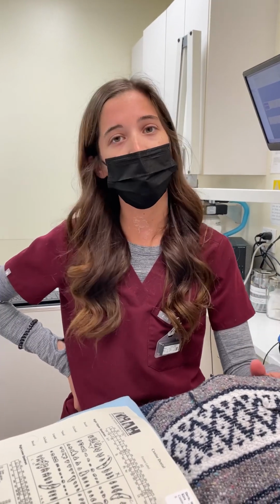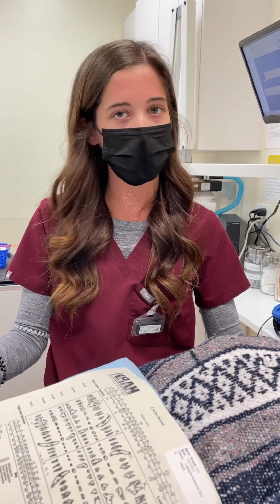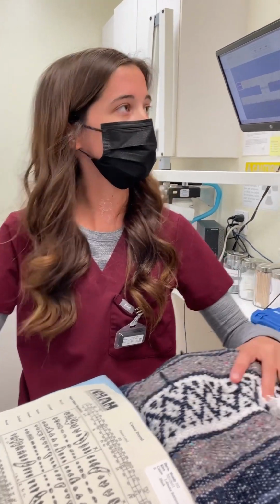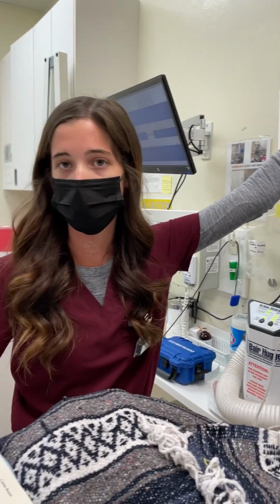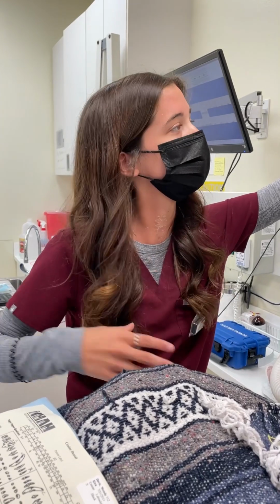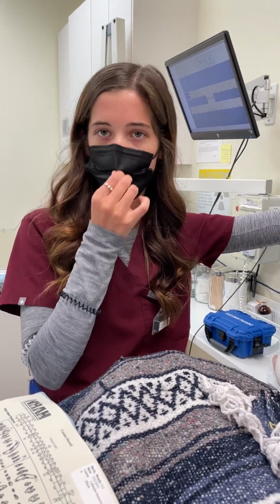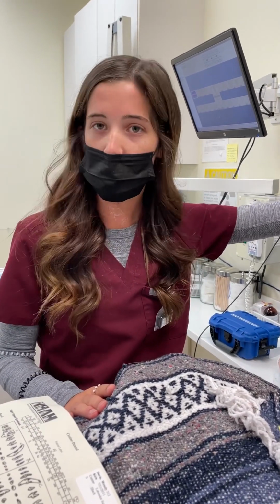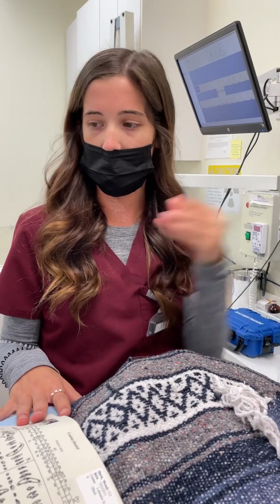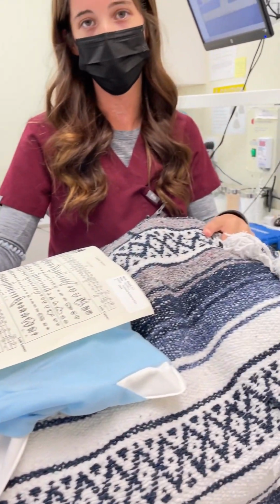Alrighty, and then when we are monitoring our patients under anesthesia, it's just like monitoring humans under anesthesia. So we do have an EKG hooked up to the patient, making sure their heart rate is nice and normal. We do have oxygen saturation on their tongue, making sure that they have enough oxygen going throughout their bodies. We do have our respiration rate going, making sure they're breathing on their own, helping them out. Blood pressure, making sure their blood pressure is normal, and then they are in a nice tray with heat on them so they stay nice and warm, body temperature.